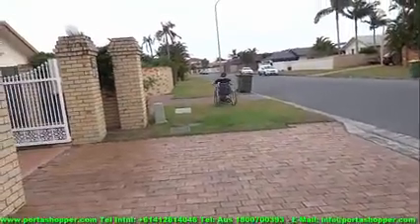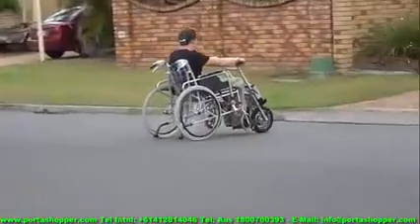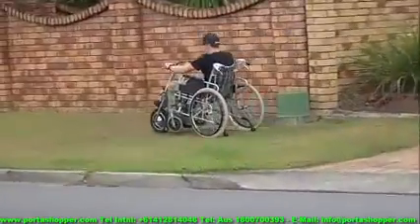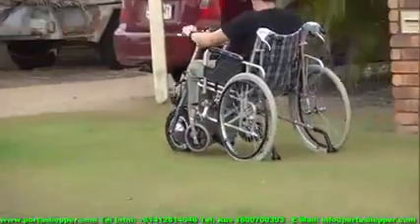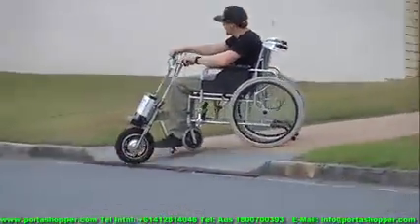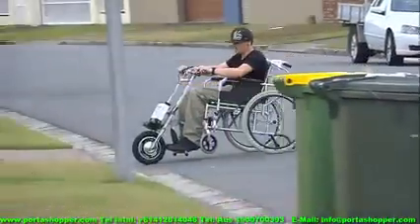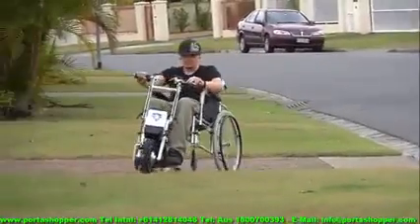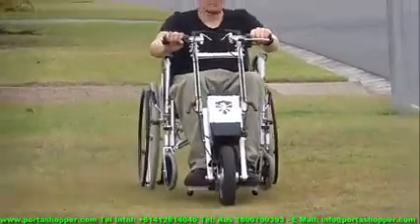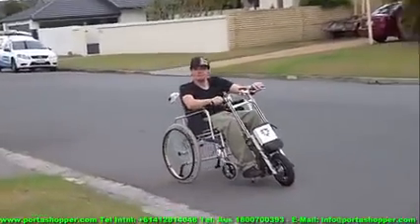Here you can see how important it is to adjust the angle of the tow bar so you have enough clearance on the casters to cross over steep driveways, gutters and other obstacles without catching the ground. This is normally achieved by adjusting the tow bar sticking out from your wheelchair to point down as low as possible towards the ground, whilst adjusting the tow hitch sticking out from the Porter Wheel drive unit to be horizontal or even facing downwards by 3 to 5 degrees. You can also adjust the height of the Porter Wheel stand to make sure that the tow hook slot lines up perfectly with the lowest bolt on the tow bar.